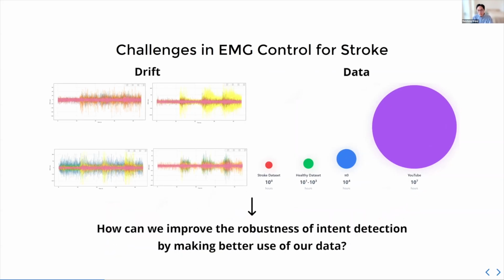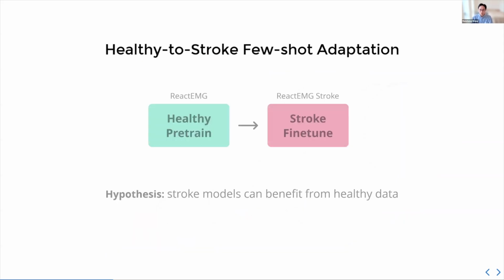That being said, given how much data we have and how non-stationary EMG can be, what's the best approach here? We decided to go with a pre-training and fine-tuning approach. Typically, you find this in vision and NLP, where it is very common. But in our case, our pre-training population is healthy and our fine-tuning population is stroke.